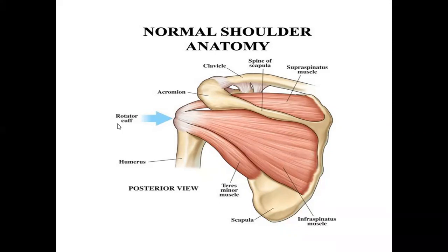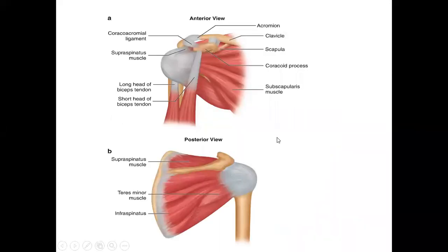Posteriorly, again, I also want to demonstrate anteriorly. Sorry, anteriorly, we have to also demonstrate how these muscles relate to the proximal portion. The most important thing to understand here is the biceps. The biceps has got 2 heads, which originate from the scapula. This is the short head of the biceps muscle, and then this is the long head of the biceps muscle.